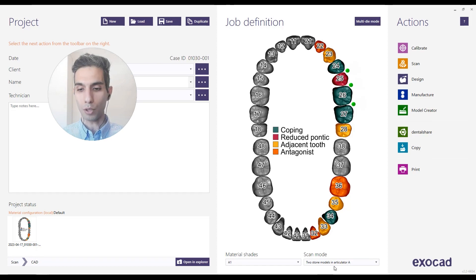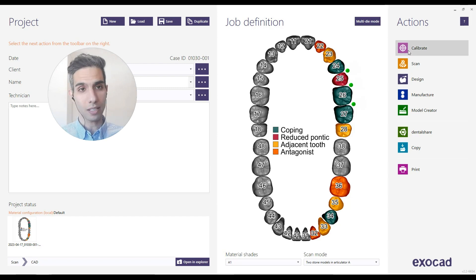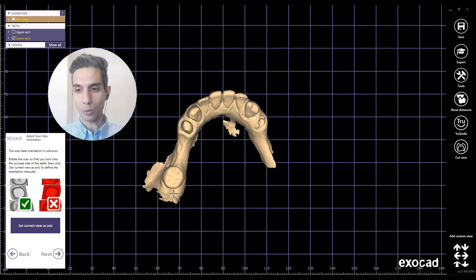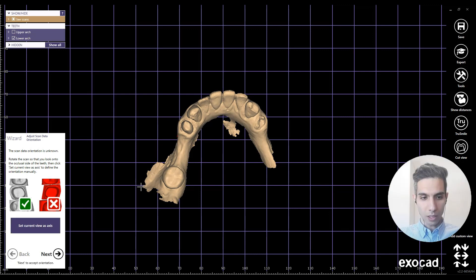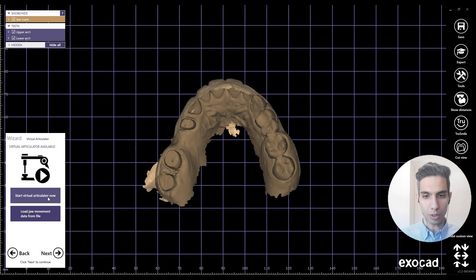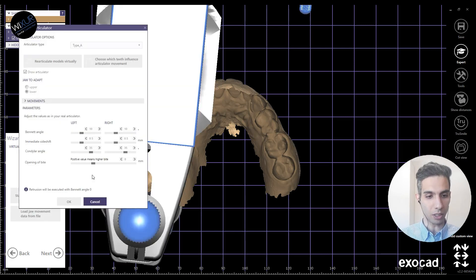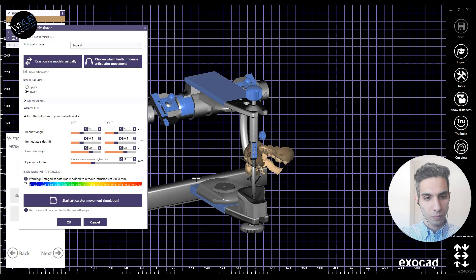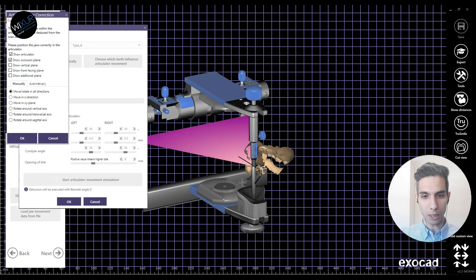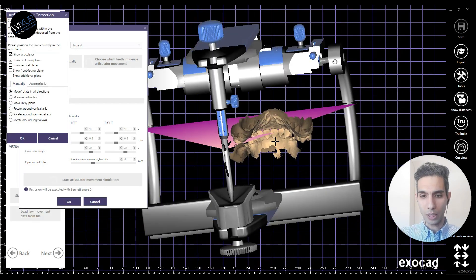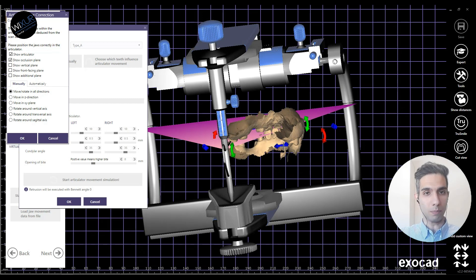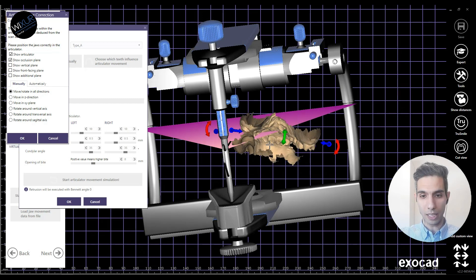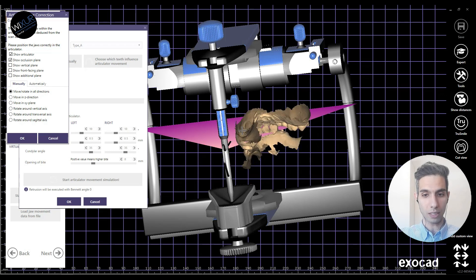Here in DentalDB I've chosen two stone models in Articulator A. As a sample, this is an Artex style articulator, so let's start. The current view is good for the insertion direction and we are going to start the virtual articulator here. What I need to do is recalculate models virtually, because the software enables me to position the upper and lower jaws in the articulator using horizontal and vertical planes.